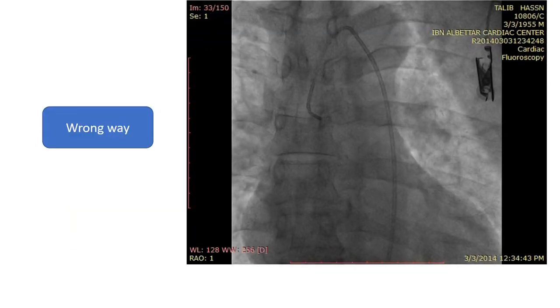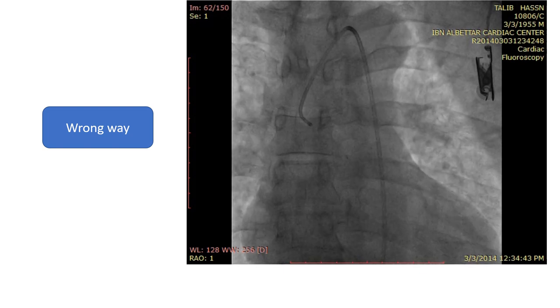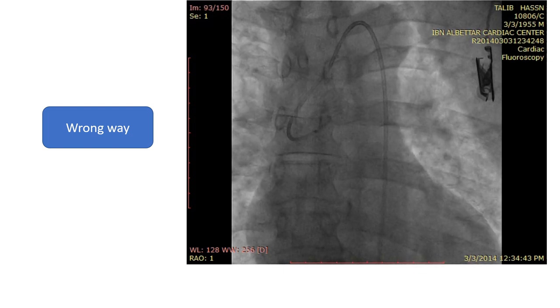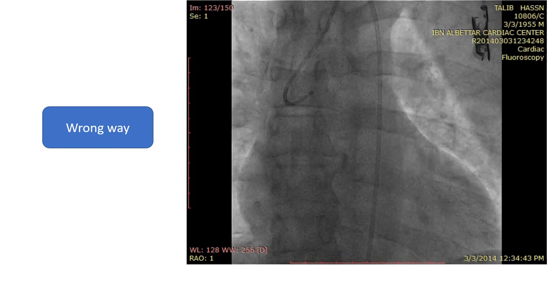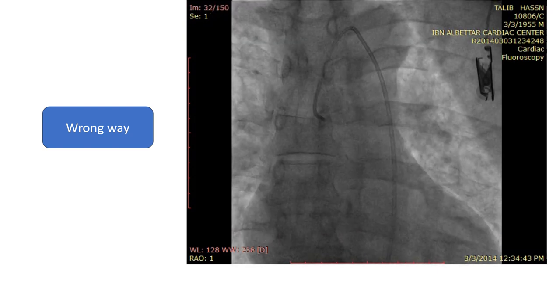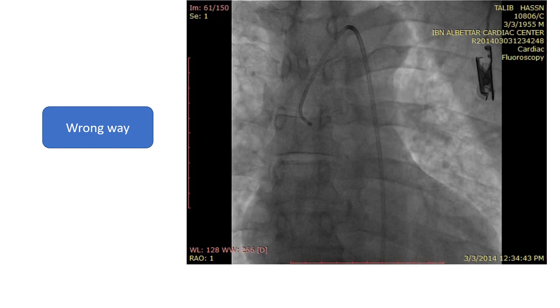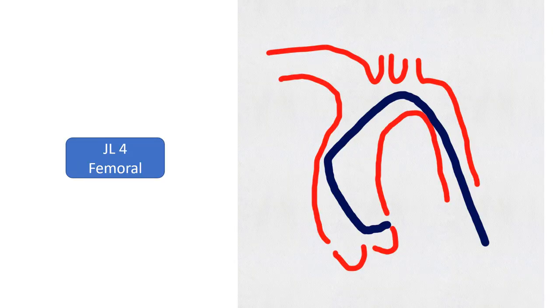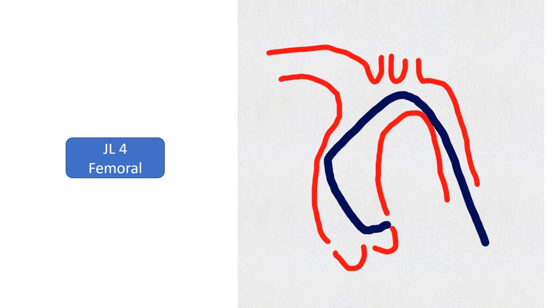When the catheter is manipulated and rotated while still in the ascending aorta, its direction is going to change and engagement will be difficult, as shown in this case. In most cases, a Judkins left 4, JL4, is optimal to engage the left coronary artery from femoral approach.